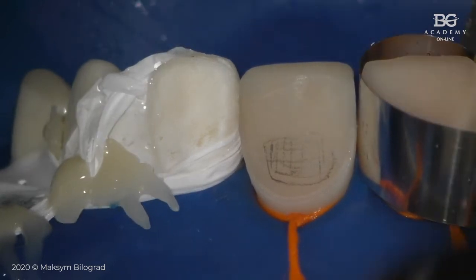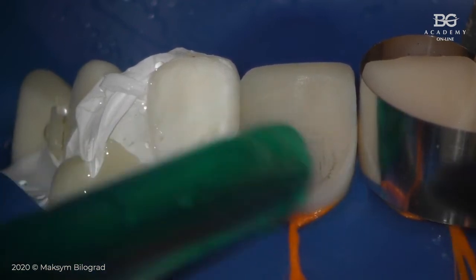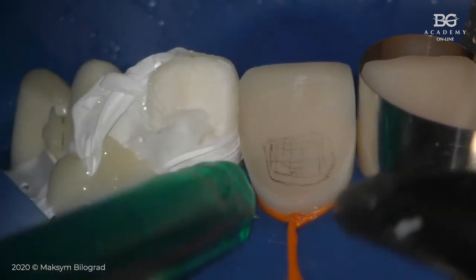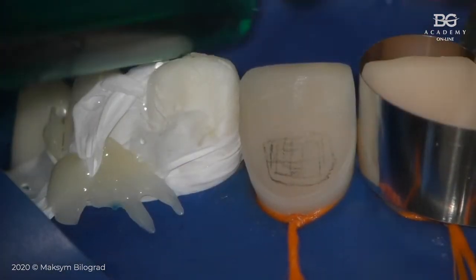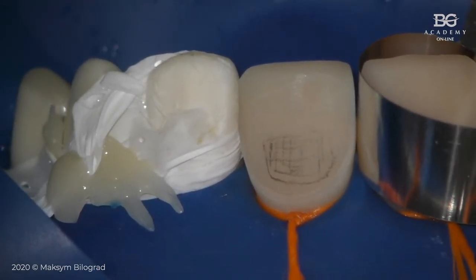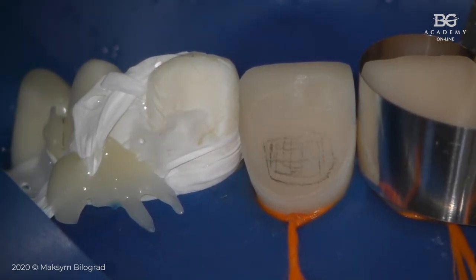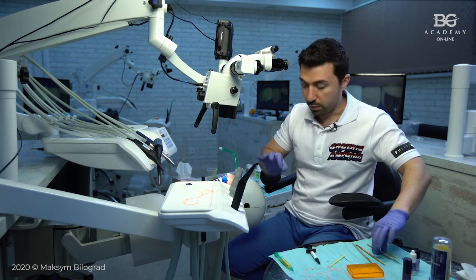So in this case, again, we will dry gently, not to over dry. Then you take your suction, take some water out from this area. When there is filling, it has to be dry. Okay, and now, when we have filling here, once you etch enamel, it doesn't matter what type of adhesive system we are using right now, total etch or self-etch, but we have this filling here.